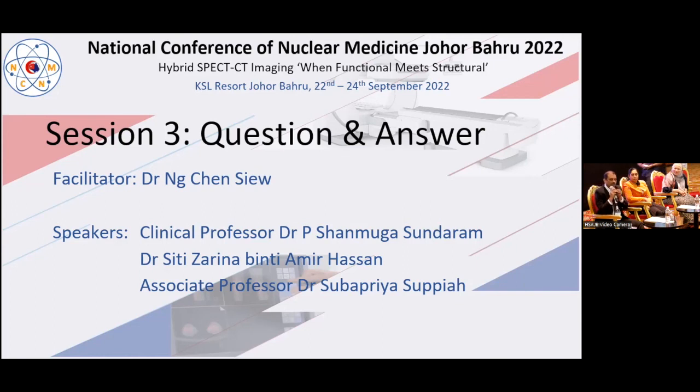I think for clarity, for teaching purposes, I will suggest the initial image should be done between 10 to 15 minutes post injection. And for the delayed scan, some people say it is 2 hours, some people say it is 4 hours. I think anything between 2 to 4 hours is fine. Why am I doing that 1 hour image? Probably as an intermediary between what we have discussed, to look for that rapidly washing out parathyroid adenoma also.